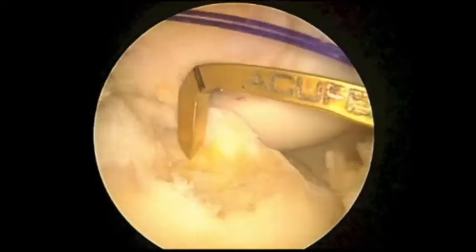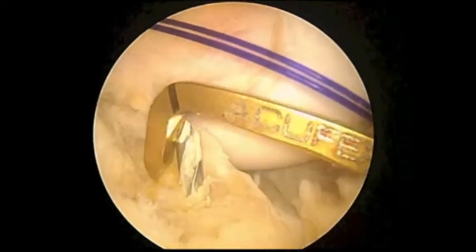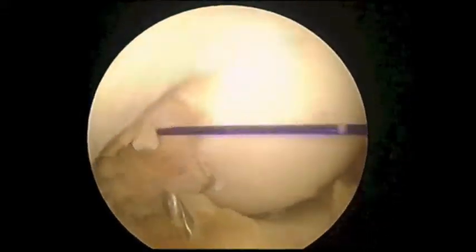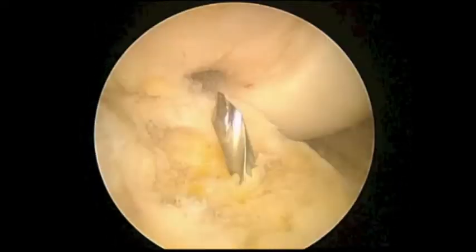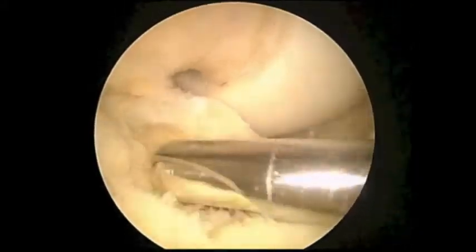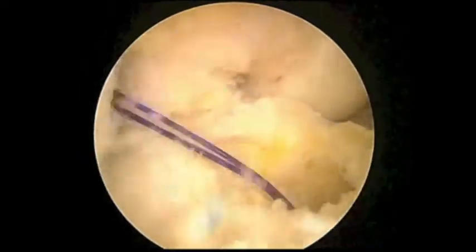Once this has been performed, we'll drill our tunnel in our shin bone called the tibia. We want this to come right through the footprint of that native ACL that we removed earlier in the procedure. Take the knee through a range of motion also to ensure that there won't be any impingement, which could cause a lack of full extension in the knee if we're too far to the front of the knee with our graft tunnel here. Now we drill our tunnel and pull our suture down through that will be used to shuttle our graft.